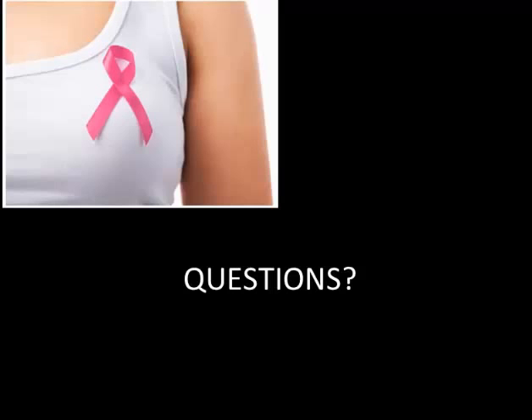I have a question actually, just a short one. Is there a way you can localize the tumor with a wire localization? I know you talked about clipping, so that's a good one, but is there a way you can save a mammogram for the patient for wire localization? Yes. You can put a wire loc in the same way as putting the clip, just as in the biopsy. And I'm sure that's in your system too? It's the same.